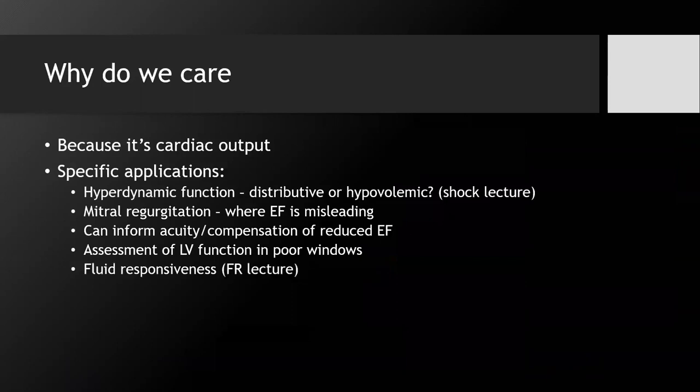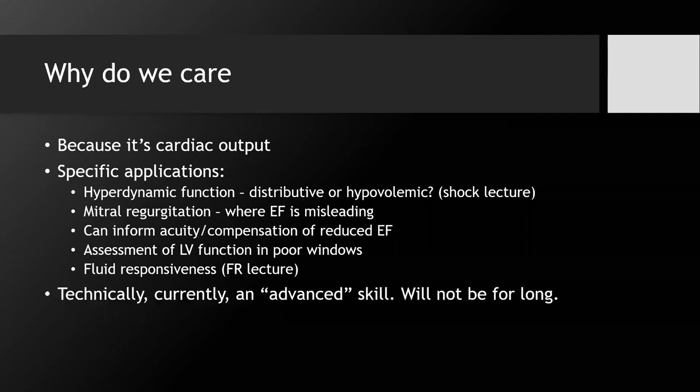So some specific applications, like I'm mentioning: hyperdynamic function, MR, you can inform the acuity and compensation of reduced EF, and poor windows. We're also going to talk about the use of cardiac output measurement when we have our fluid responsiveness lecture. So technically, this is still an advanced skill. It's not going to be for long, but it does require a proficiency with basic image acquisition. So if you're not there yet, this is going to be a future skill.